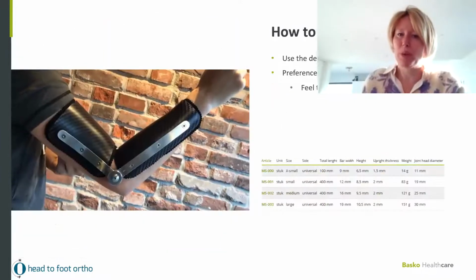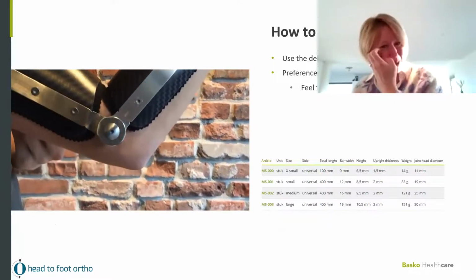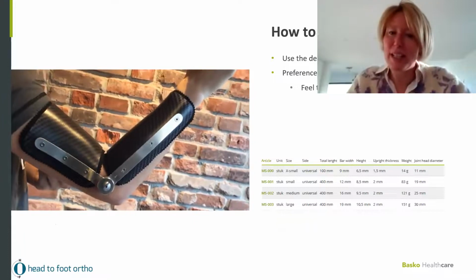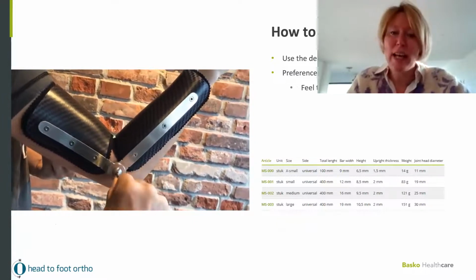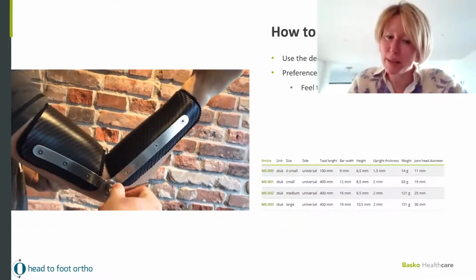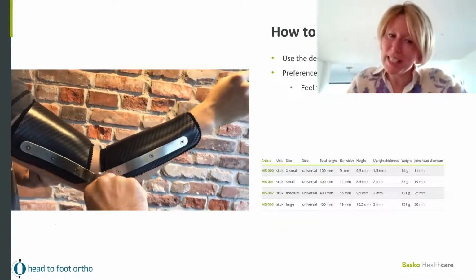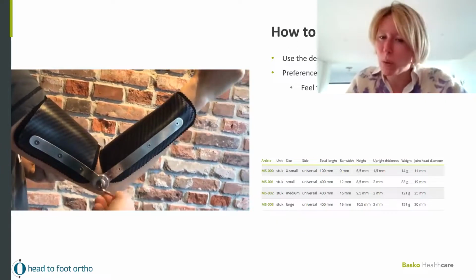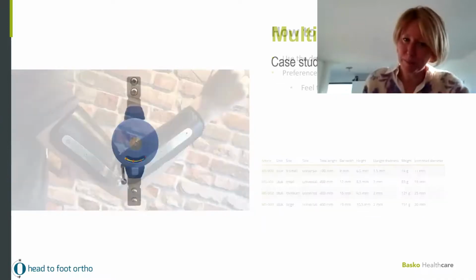This is how multistatic works. If the person can get the Allen key in, we always laugh, but it's just a human. There is a key delivered, and you can change the position just by turning the Allen key. And you can feel, because you do it on the patient and it's a small joint, you feel the resistance of the patient. So even by treating statically, this is one of the most beautiful joints, because you feel what you do. You're not just tearing tissue apart.